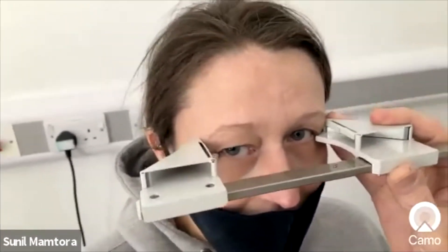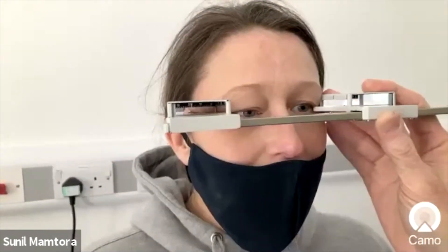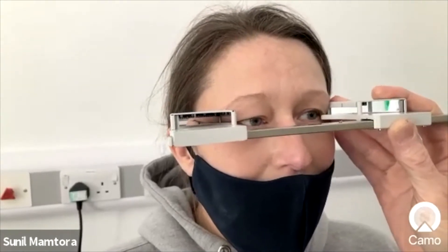You can really clearly see that there's a right-sided issue. The proptosis measurements were reading 17 and 12 in the clinic. On one side, an atrophic featureless disc, and then on the left, a completely different picture.